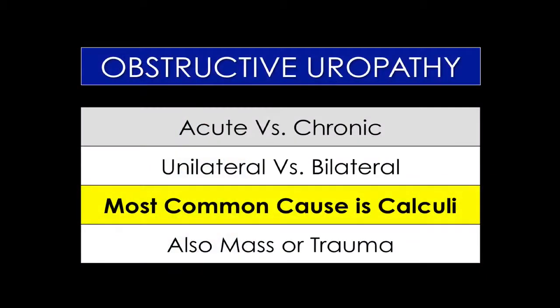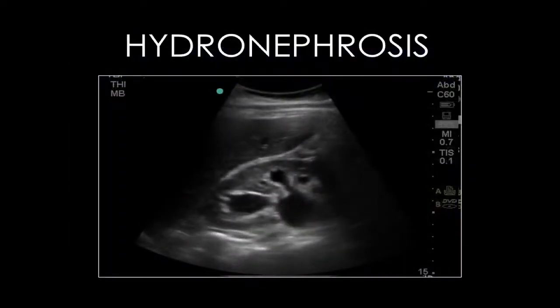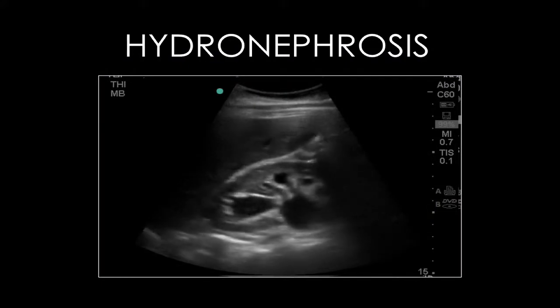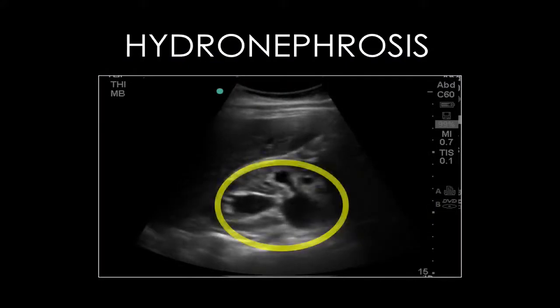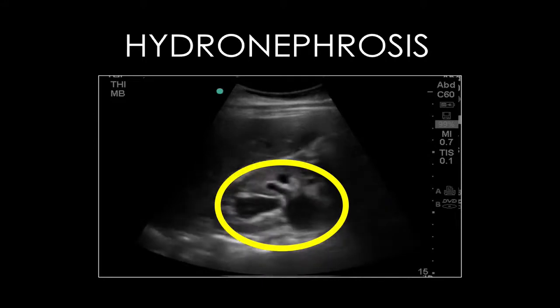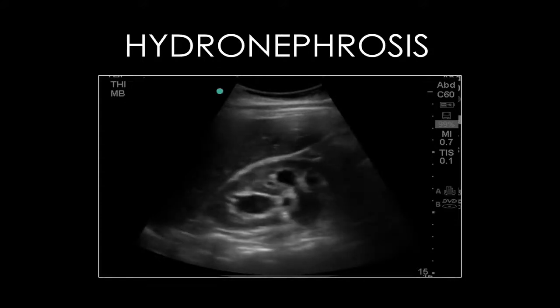Obstructive uropathy can be acute or chronic and unilateral or bilateral. The most common cause of obstruction is calculi that develop in the kidney and become lodged in the ureter. However, a mass or trauma can also cause renal obstruction. Obstructive uropathy causes dilatation of the collecting system in the kidney, seen on ultrasound as anechoic fluid expanding the renal sinus. In this video, it is easy to see how the pressure created by a stone obstructing the ureter has caused this to occur. This finding is referred to as hydronephrosis.